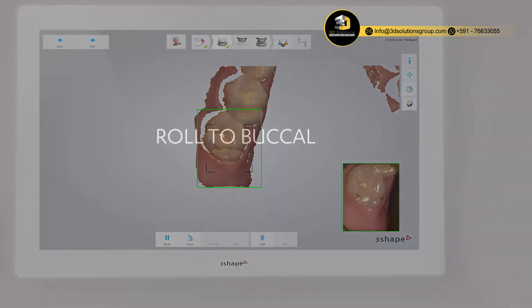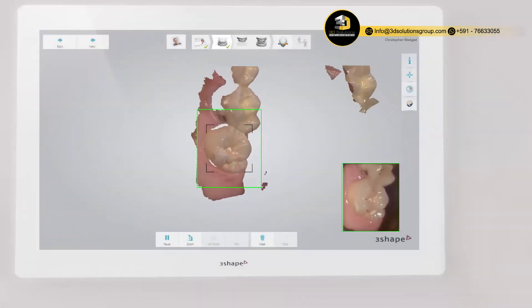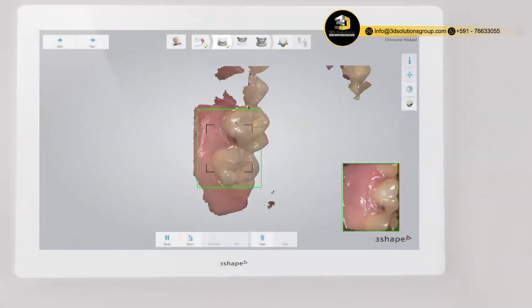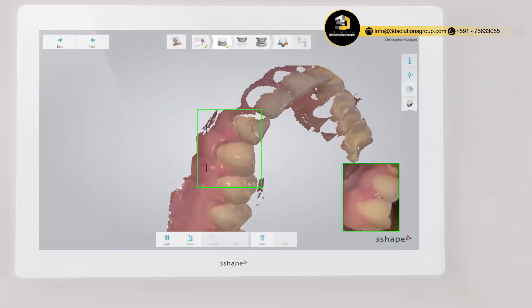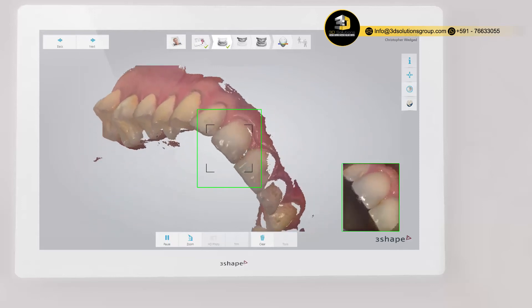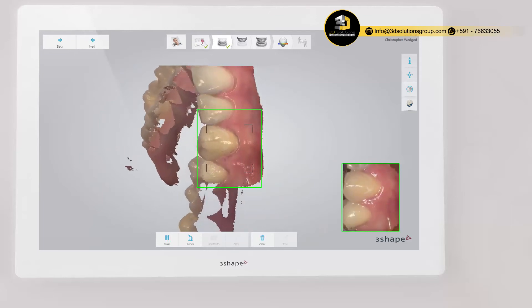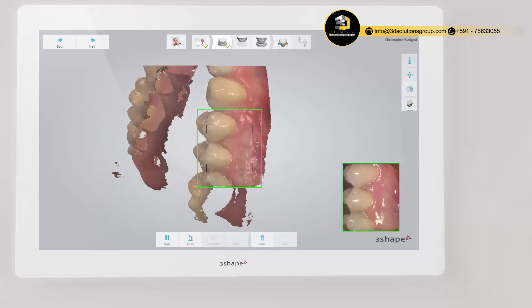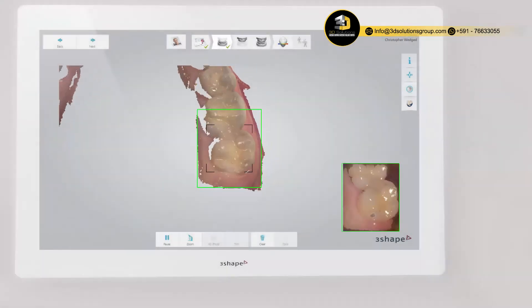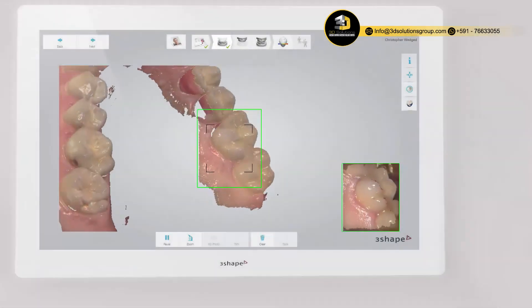Turn slowly buccal by rotating the scanner 60 to 90 degrees at the last molar and complete the buccal swipe, taking care of areas where soft tissue may interfere with the scan. Go along the buccal side until you reach the last molar on the opposite side. Then roll to the palatal side, complete the swipe, and go along the whole arch.